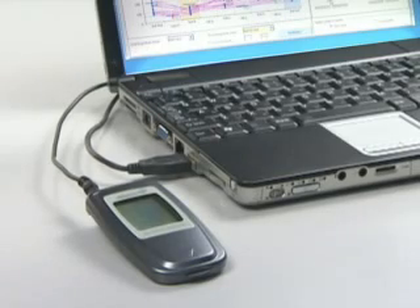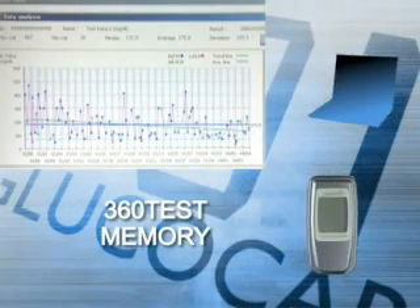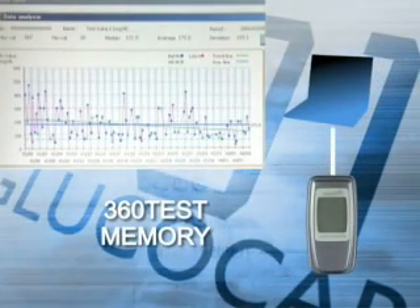Glucocard 01 stores up to 360 test results. Special software is available for convenient computer management of measurements.